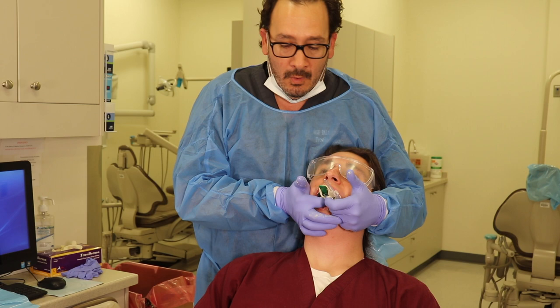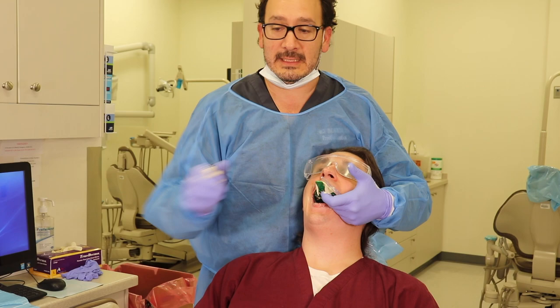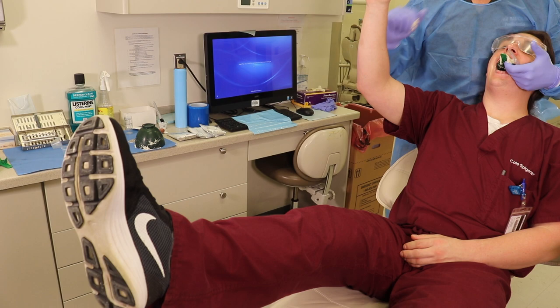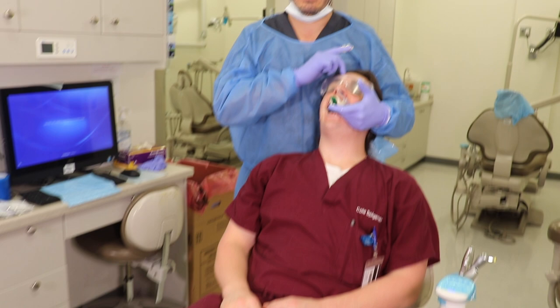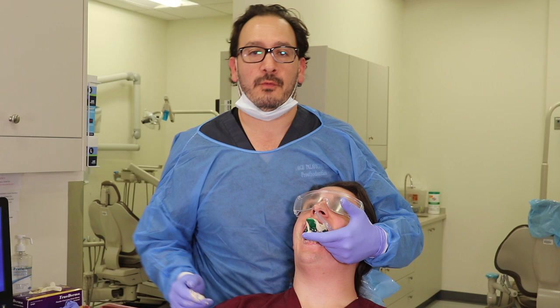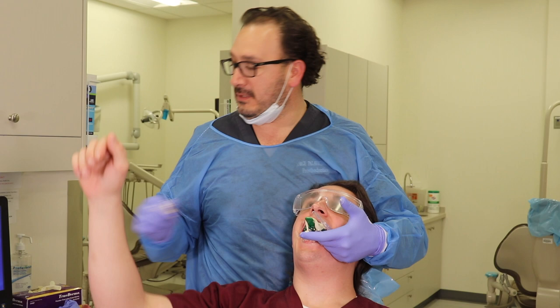If by any chance the patient starts gagging, I will ask him to lift up the right hand, right foot, for 5 seconds, and then switch to the other one. This is not gonna prevent him from gagging, but he's gonna take his mind off the gagging reflex, okay? I can ask him to raise the hand. I just need to distract him and take the mind off the fact that he's gagging, okay?